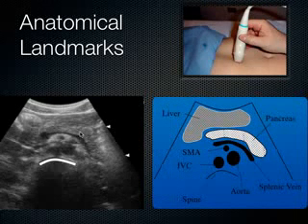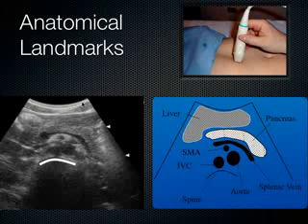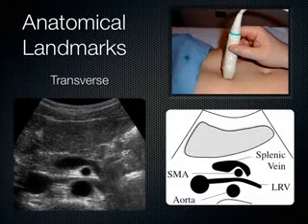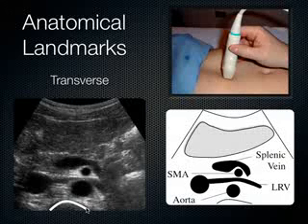And then the organ that lies right on top of the splenic vein is the pancreas. Here's the tail of the pancreas. Here's the body of the pancreas. Now, based on this probe's footprint, which probe do you think we're using? C60, exactly right. So we don't have those upstairs. We got the P21s, and they do okay, but ideally, when you're talking about the aorta, the C60 does make the best images.